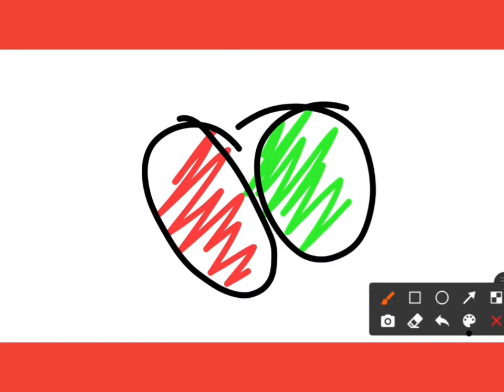This duochrome test is based on chromatic aberration. It is a subjective test to assess the spherical endpoint. In this video I will tell you how this duochrome test actually works. I am showing you the duochrome screen.